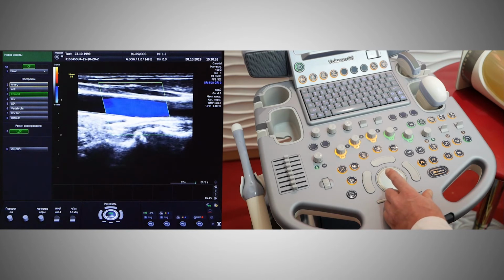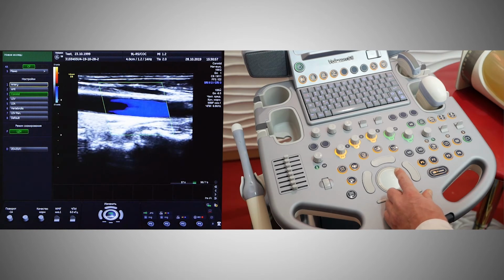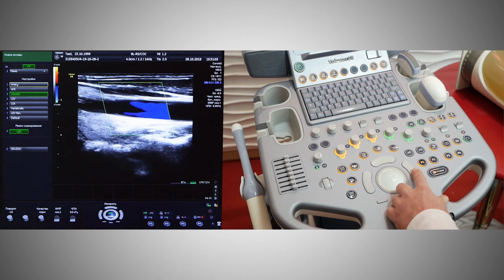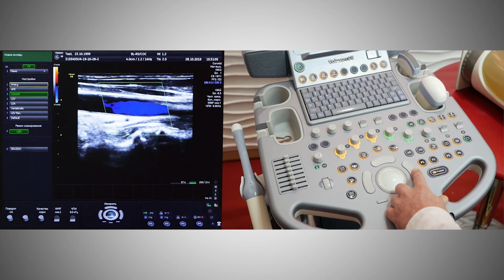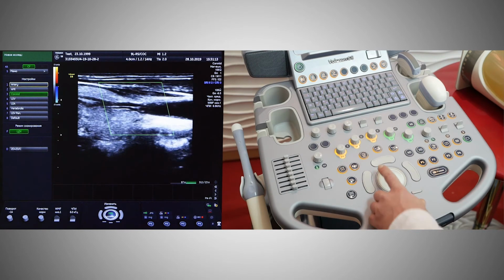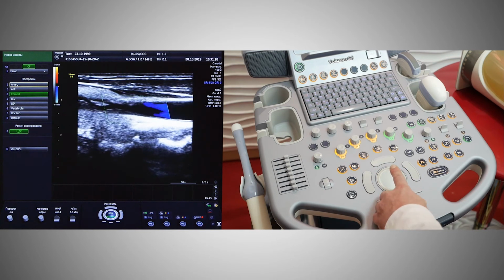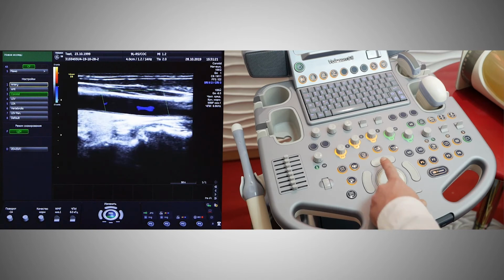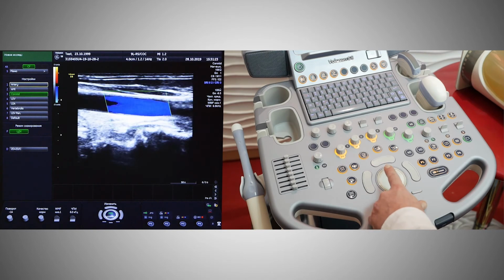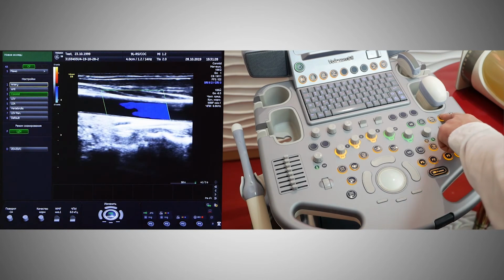That is a color Doppler. To change the size of the control volume or the active color Doppler window is changed with the help of trackball keys. By clicking on it, we can change the size of the control volume. By clicking again, we change the position of the control volume for further examination.